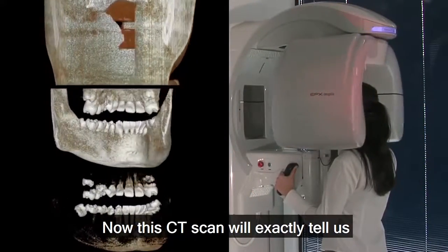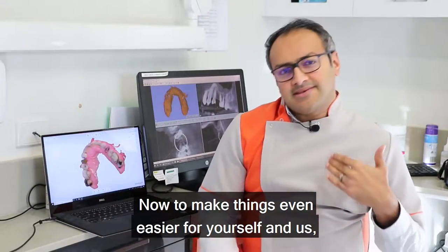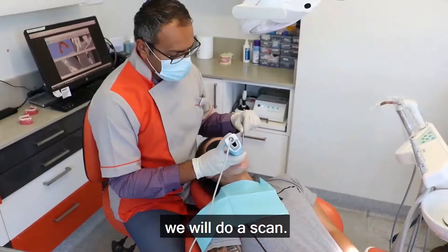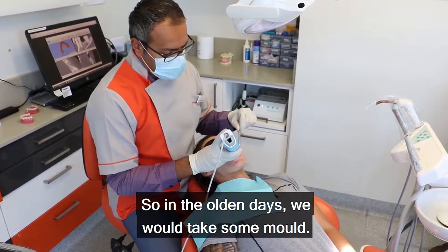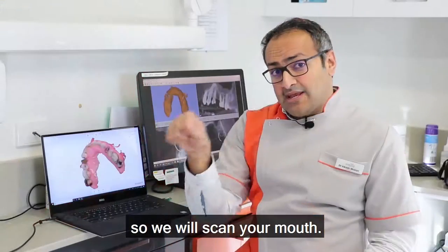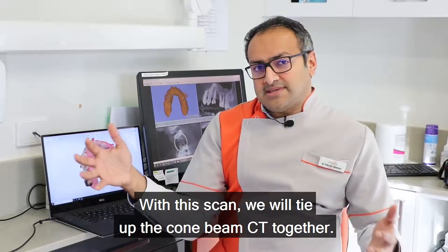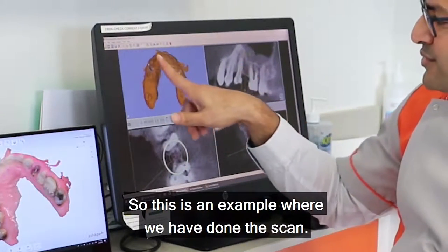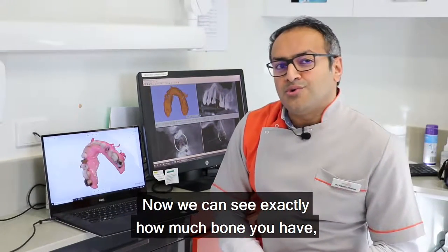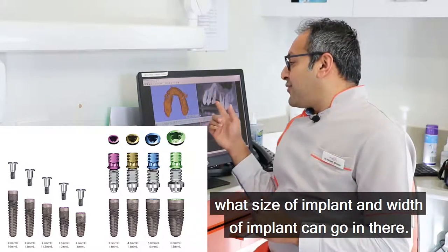This CT scan will tell us exactly how much bone you have. In the olden days we would take molds, but we're lucky enough to have digital technology, so we will scan your mouth. We then tie up the cone beam CT together with the scan. This is an example where we've done the scan — we can see exactly how much bone you have, and what size and width of implant can go in there.